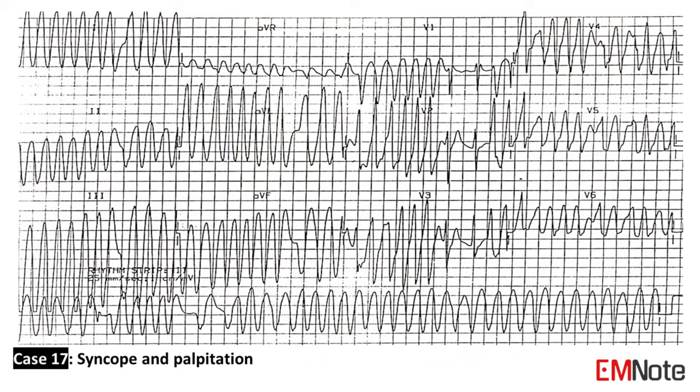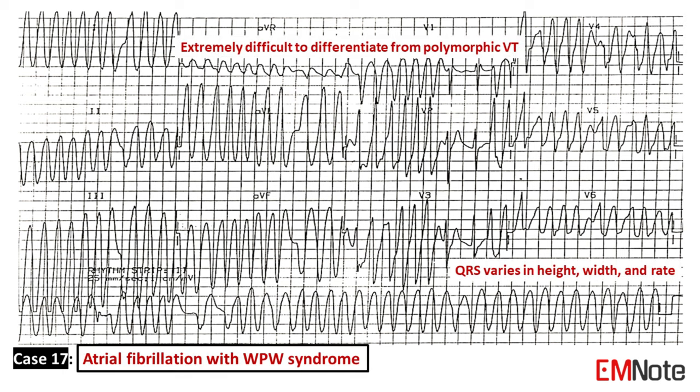Case 17: The patient presents with syncope and palpitation. The ECG shows a wide irregular rhythm with heart rates approaching 300 per minute in some places. The wide QRS complex is due to abnormal ventricular depolarization via an accessory pathway. The ECG features are compatible with atrial fibrillation and pre-excitation, such as WPW syndrome. Features include irregular rhythm with extremely high rates greater than 200 per minute, wide QRS complex, and beat-to-beat variation in QRS morphology with stable QRS axis, unlike polymorphic VT.